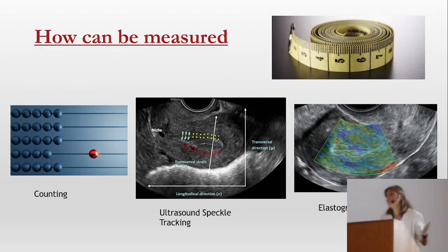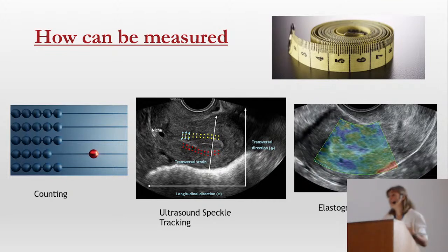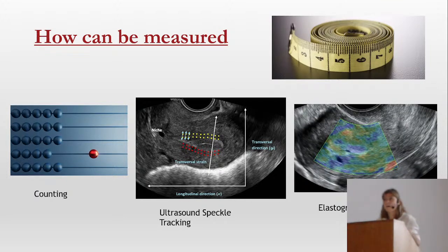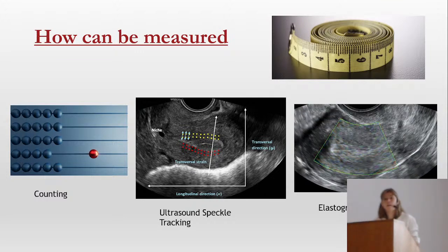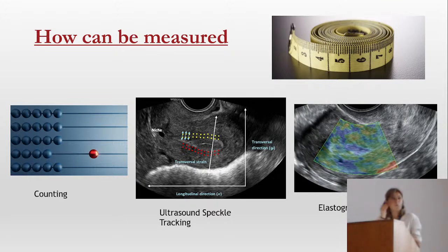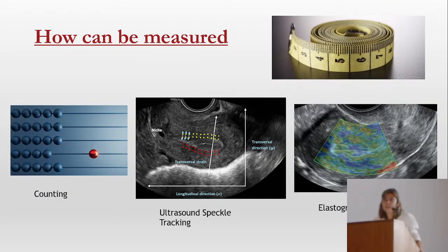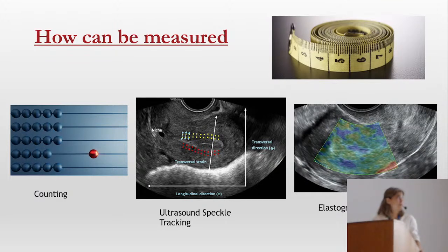One is counting. I'm doing that. And obviously, it's subjective. You can do reproducibility studies to see that, and more or less they have a good point, but it's subjective anyway. Then it's very interesting, the ultrasound speckle tracking.